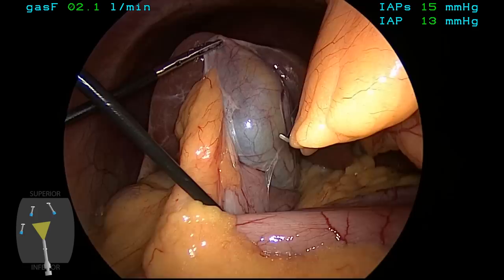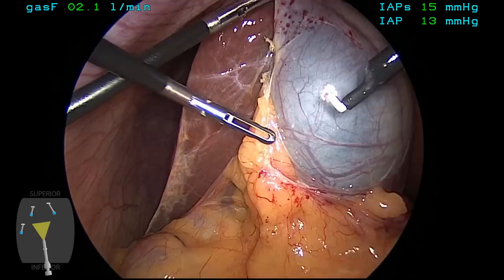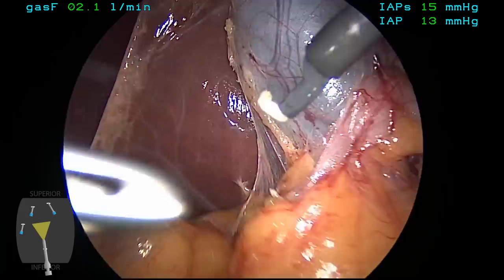At this point, the gallbladder is elevated, and some retraction is placed on some omental adhesions which signifies the patient's been having biliary colic-type symptoms, and these are divided using an L-hook monopolar electrosurgical instrument. One has to be very careful doing this with short bursts of energy and to be right at the interface between the adhesion and the gallbladder.